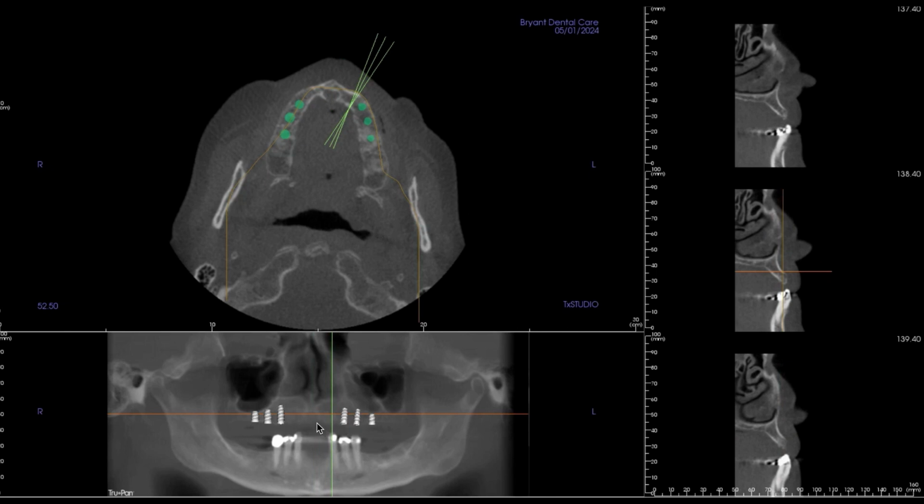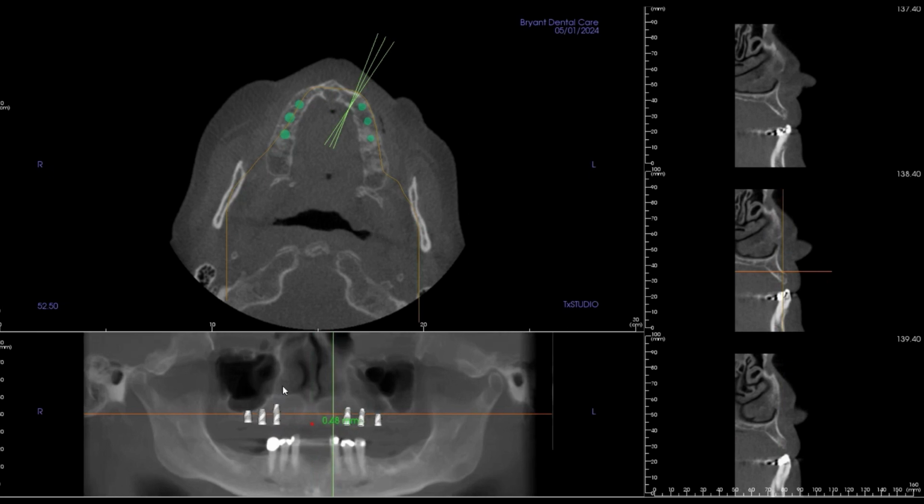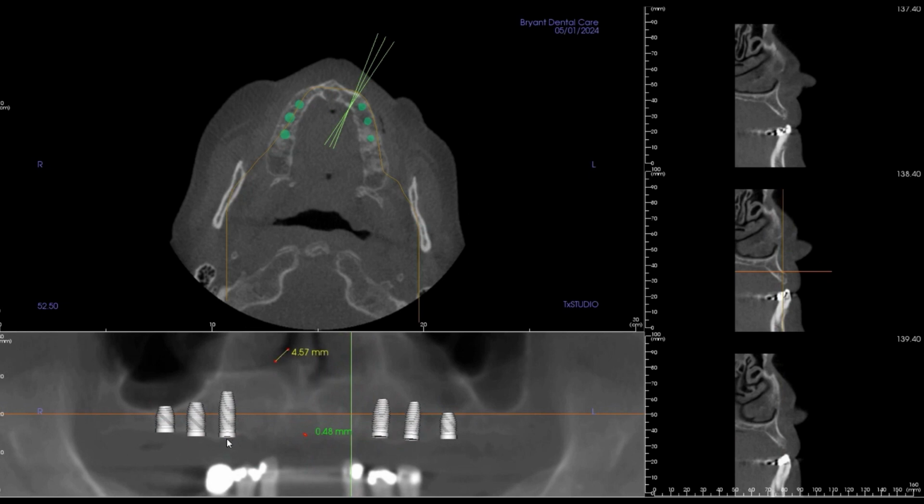So 3 implants, measuring from the midline to that first implant. Let's take a look. Somewhere around 20 millimeters. To make it easy, I would just do 19 and 19 from the midline. And then from center to center, you're looking at 8 millimeters, and 8 millimeters. So 19, 8, and 8.